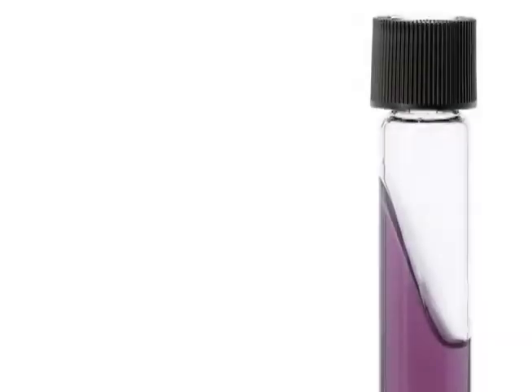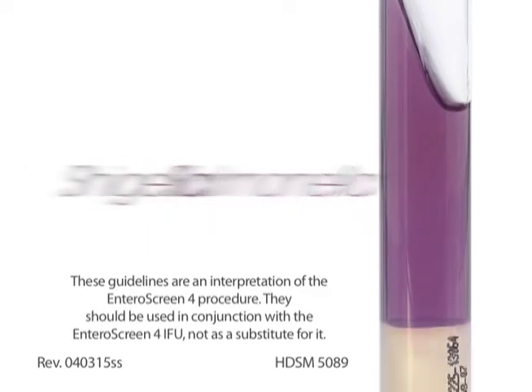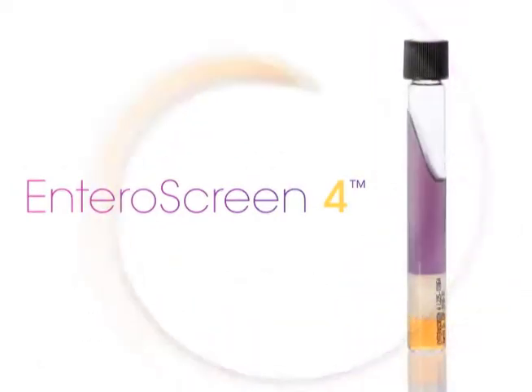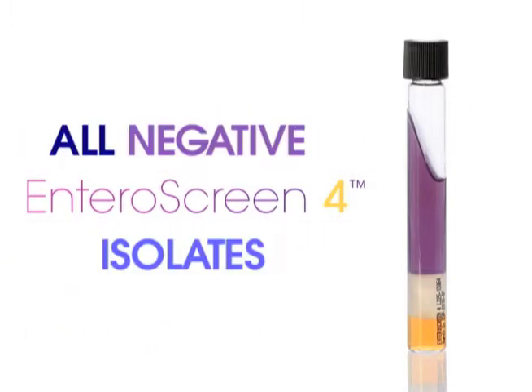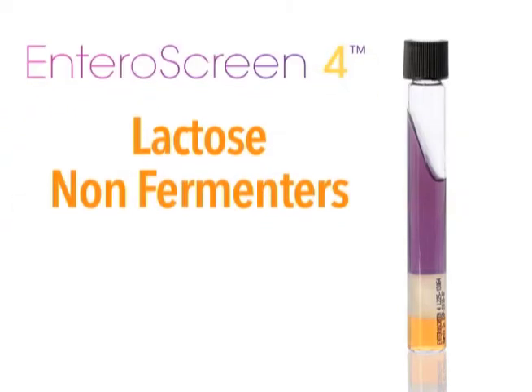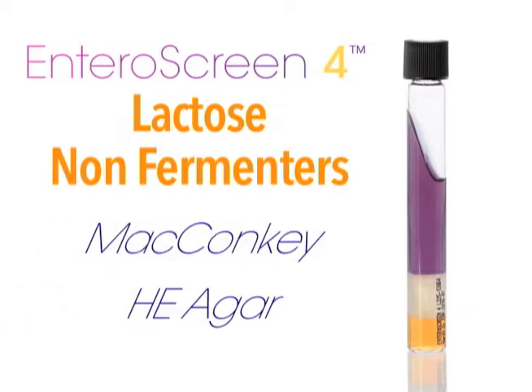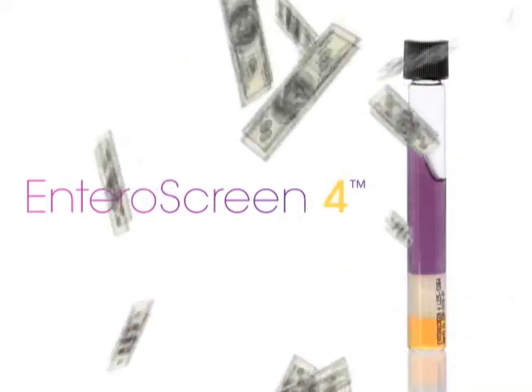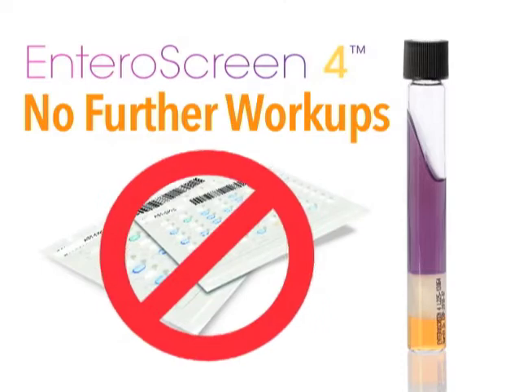Are you looking for an easy way to screen your stool culture isolates for Salmonella and Shigella? The Hardy Enteroscreen 4 system represents a one-tube method that will quickly screen out all of your negative isolates, rather than having to identify all the lactose non-fermentors on your stool media, such as McConkey or HE agar plates. Enteroscreen 4 allows you to inexpensively screen out all the non-pathogens so you don't have to do any further workup.